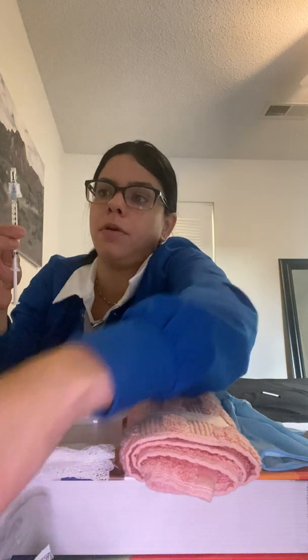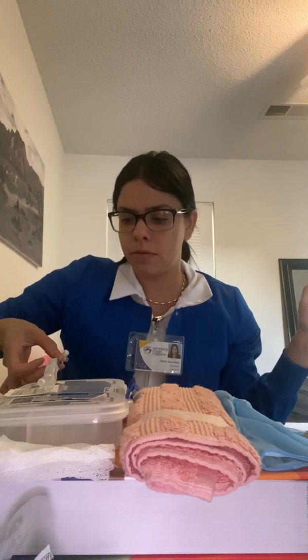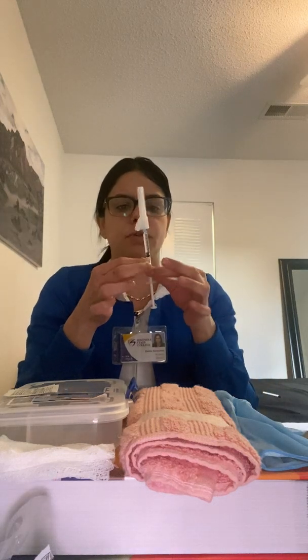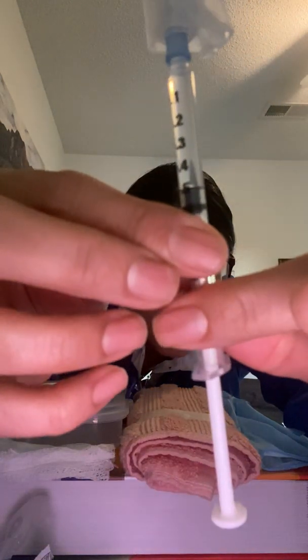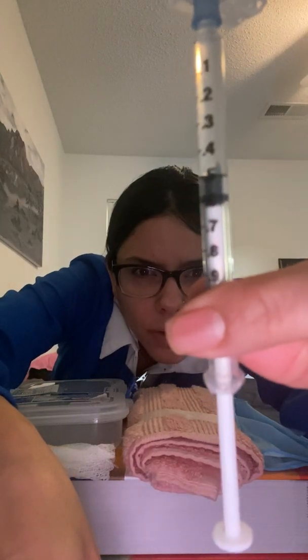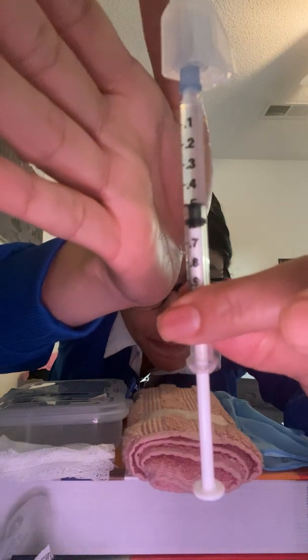I don't need this anymore, and I am going to do the one hand scoop technique. Scoop. There you go. And let me show you. I have 0.5 ml of my medication. Hopefully you can see that. I have 0.5 ml of my medication.